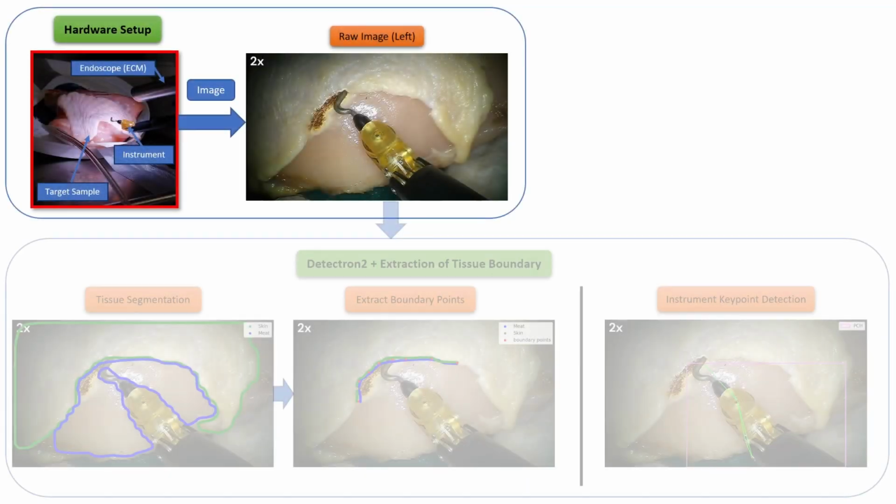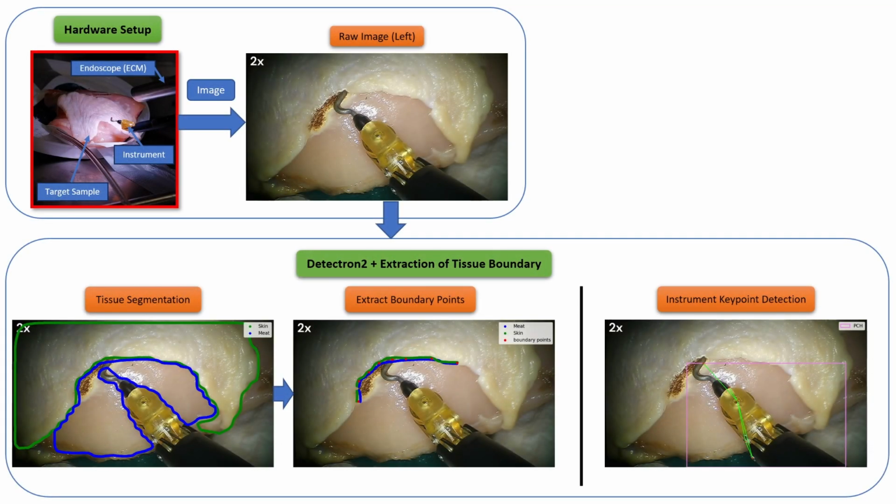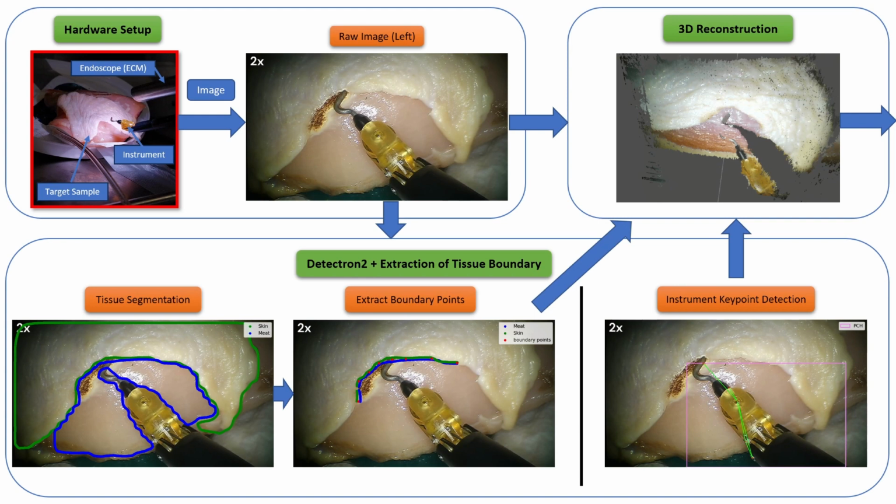To tackle the challenges, we adopted Detectron2, a model initially crafted for segmenting common objects and detecting human keypoints for pose estimation. With our custom dataset, comprising segmentations from the previous slide and keypoint annotations for surgical instruments, the robot can accurately track tissue boundaries and instrument positions through endoscopic images. Furthermore, by merging Detectron2 outputs with point clouds, we achieve precise mapping of points from the image plane to their coordinates in 3D space.